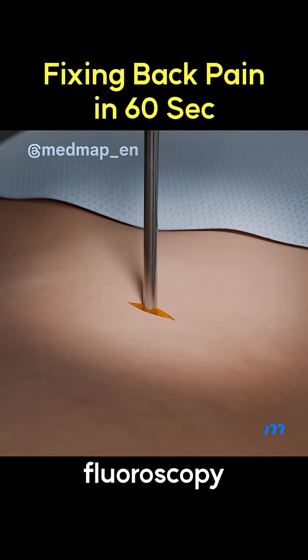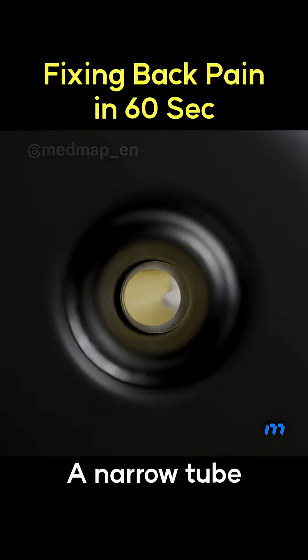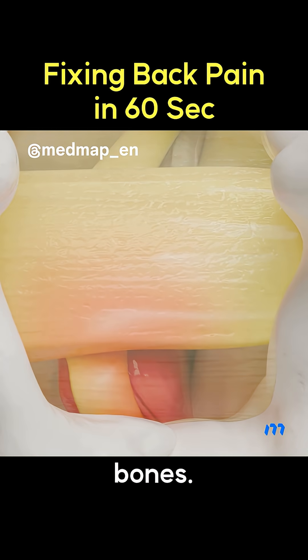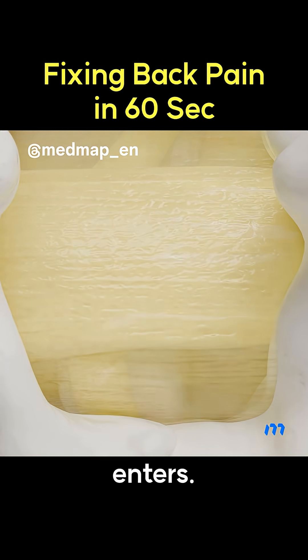A one centimeter incision is made under fluoroscopy guidance. A narrow tube passes through muscle and fat, reaching the space between the spine bones. An endoscope enters.